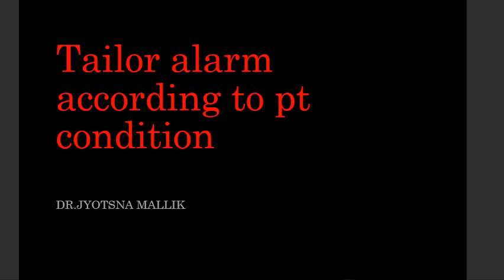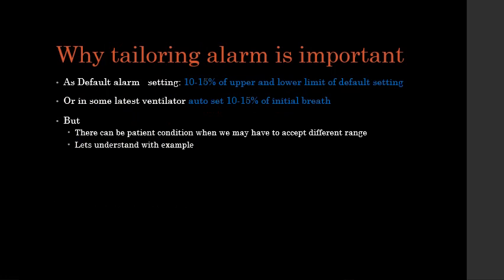I will give you some examples which will tell you how important it is, in some conditions, to tailor the ventilator alarm according to the patient's condition. It might not be required for every patient, but it may be required for any patient.